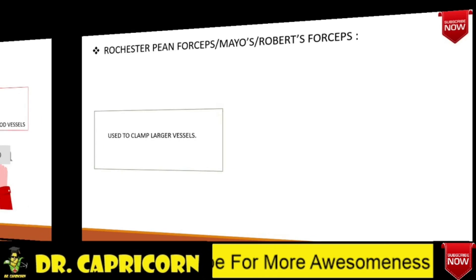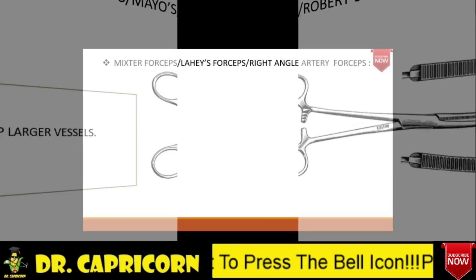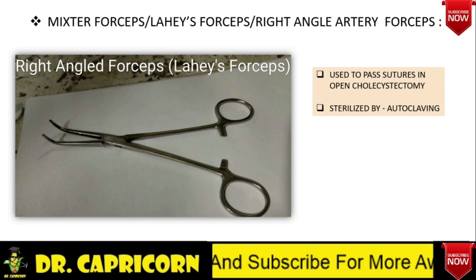Rochester PN forceps, also called as Mayo's forceps or Roberts forceps, is a large sized hemostatic artery forceps used to clamp larger vessels. Please note that the blades are longer and transversely serrated. Mixter forceps, also called as Lahey's forceps or right angled artery forceps — here you can see the tip is bent at right angle. It is used to pass suture in various surgical procedures such as open cholecystectomy. This instrument is also sterilized by autoclaving technique.